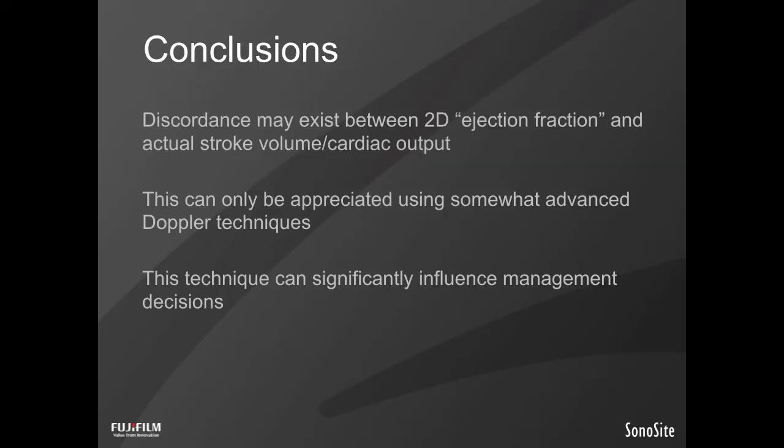And this is a point of evolution for us at the bedside. There's not a ton of practitioners using detailed stroke volume assessments, so I'm so interested in your own experiences with this, and we can open that up for questions very shortly, and I'd love to hear some of your experiences or questions about putting that into practice.